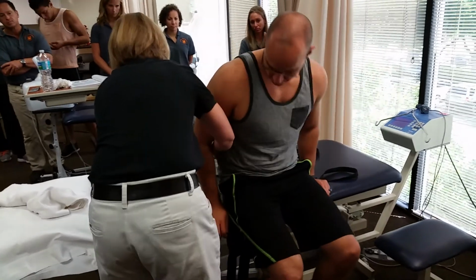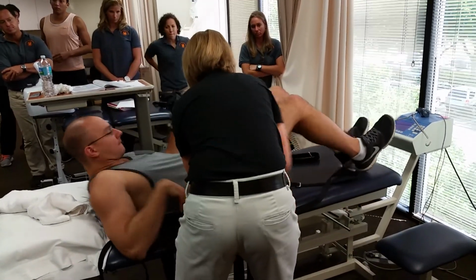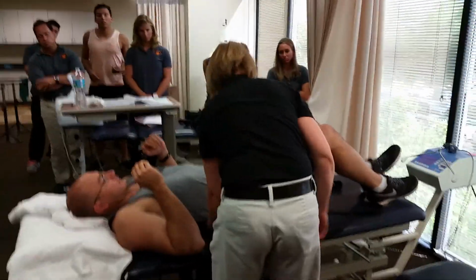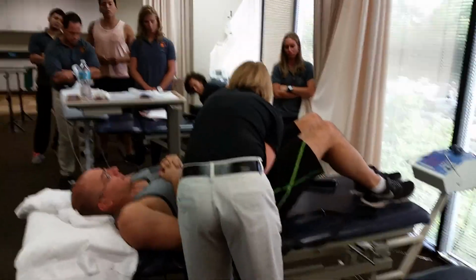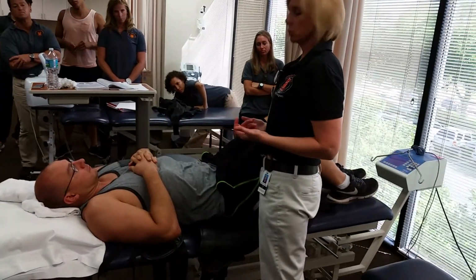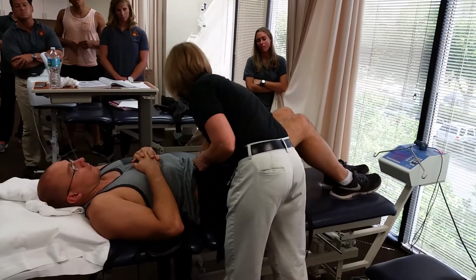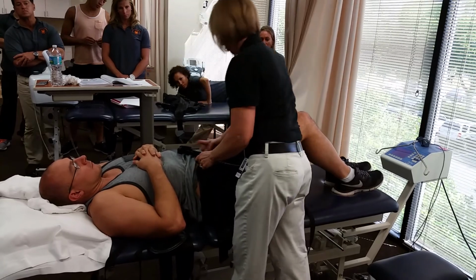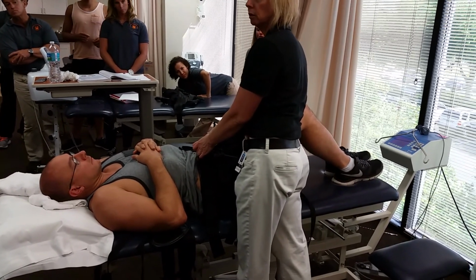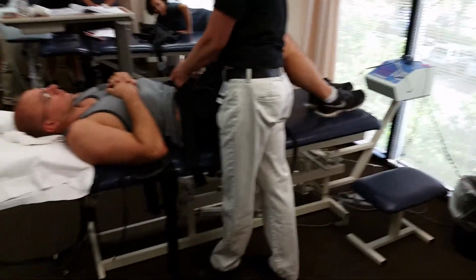Here? Mm-hmm. And then turn and lie down. Straighten yourself out. The problem is, if this is too low, you have to start having him bridge up. So then I would need to kind of lift this up. And the thing about this now is that, okay, oops, it's not even. I'm not going to get an even pull, because this one's too far forward than the other one. So now I have to kind of start shifting them.